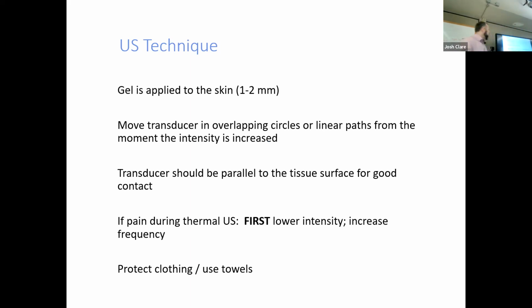The sound head should be parallel to the tissue surface for good contact. Again, we talked about that earlier. Maintain good contact. Don't have some aspects of the sound head off of the patient. If there's some complaint of discomfort, my first step would be to lower the intensity and increase the frequency. Again, get more superficial with lowering the intensity.